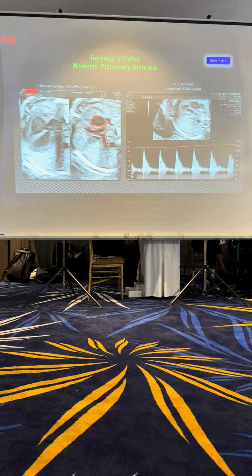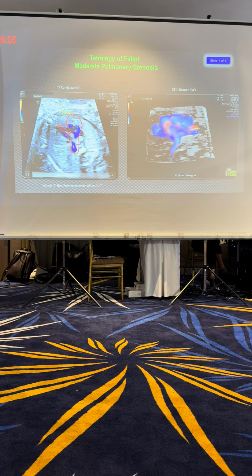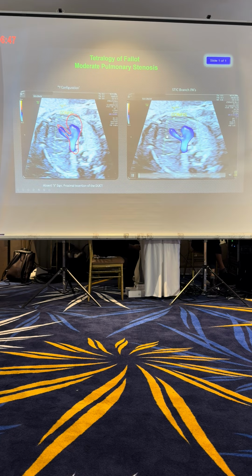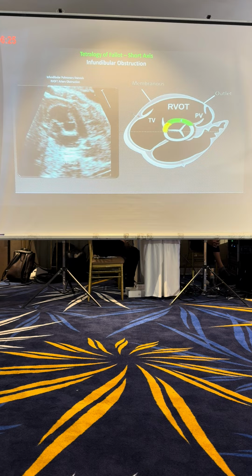Very obvious, fellows. And when I look at color Doppler on the three-vessel tracheal view, I see the Y configuration, the dilated aorta, and the narrow pulmonary artery. Tetralogy of Fallot. This is not double outlet right ventricle. This is not a common arterial trunk. And then I do a volume assessment of the same baby. I see the branch pulmonary arteries. I'm going to monitor this baby by taking Z scores of the main pulmonary artery, the right pulmonary artery and the aorta throughout the pregnancy, because somewhere between 15 to 20% of babies will progress from mild to moderate pulmonary stenosis to pulmonary atresia.